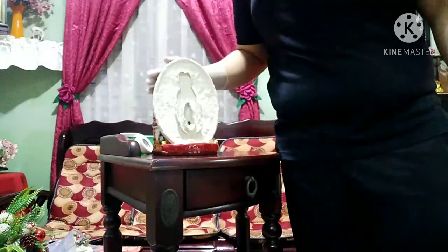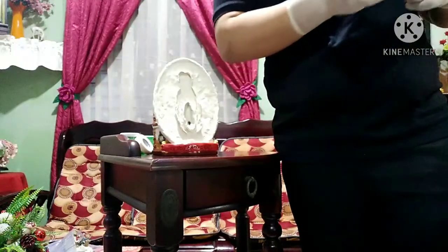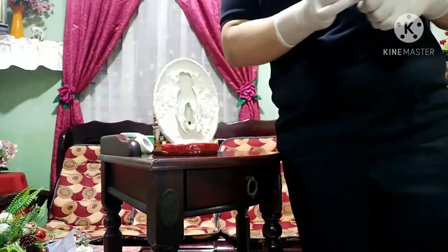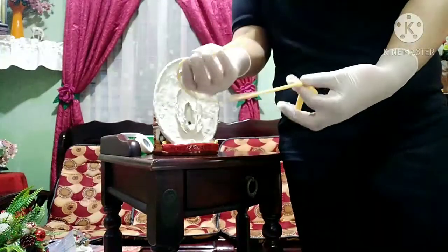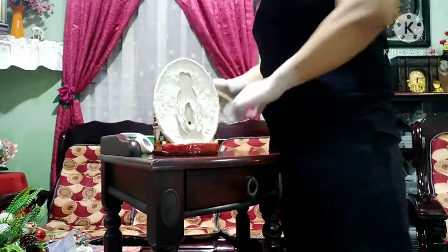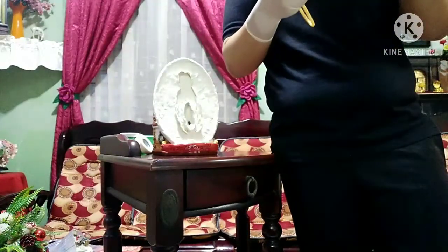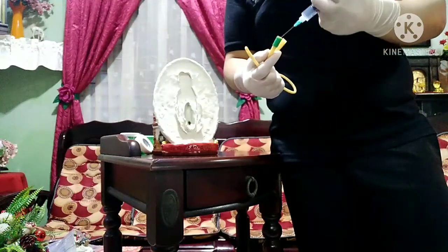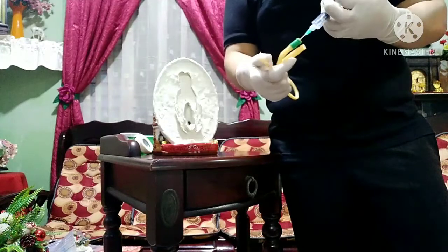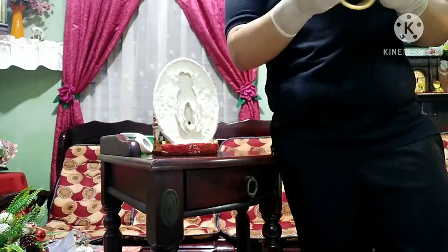Number 11 is open the package of the catheter, inflate the balloon with the prefilled syringe to check if defective, and aspirate the fluid back into the syringe. This is our catheter, the Foley catheter. This is the syringe. We will test it.